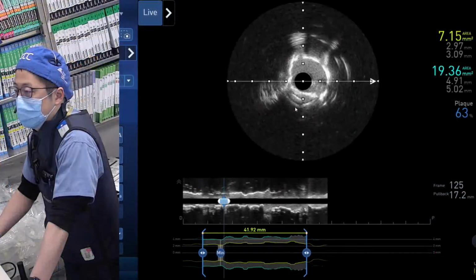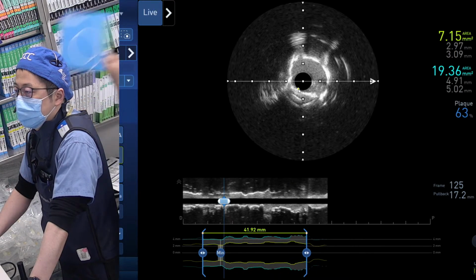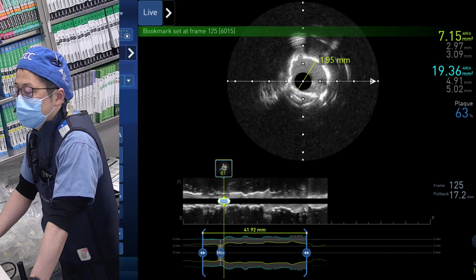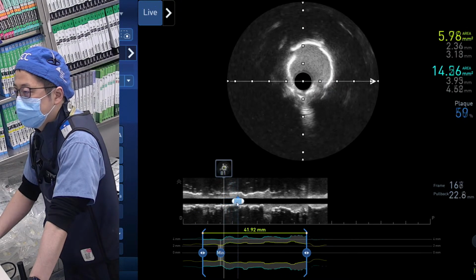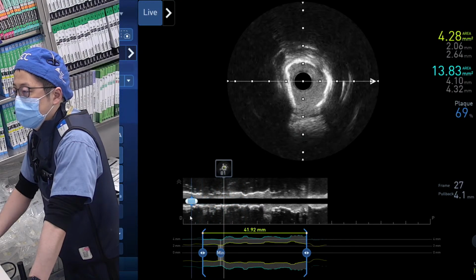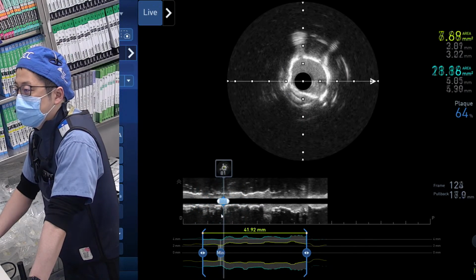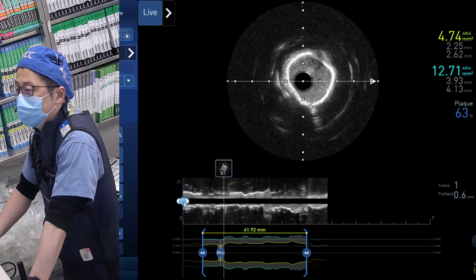What's the diameter there? Let me go with IVL there. If you want MLD, it's still 2.0. But we see some fractures. And the vessel size there, Kiski? Of course, we don't see the EEL because of the 360 calcium artifact, but from the initial pullback, the vessel size is 3.5.